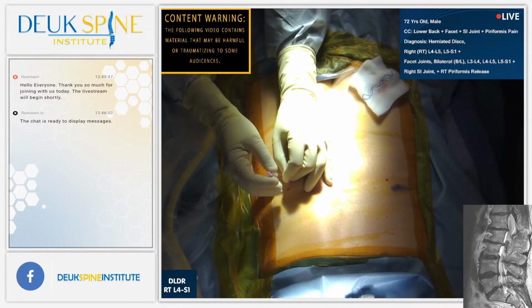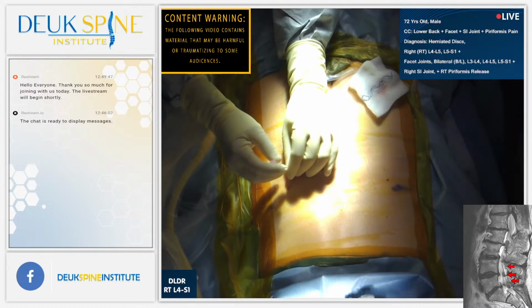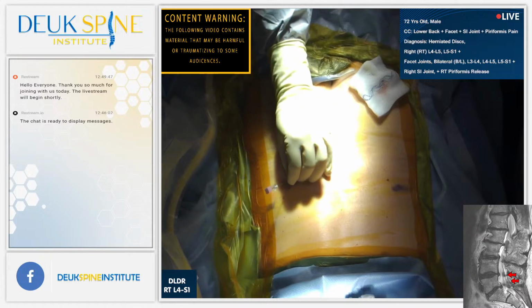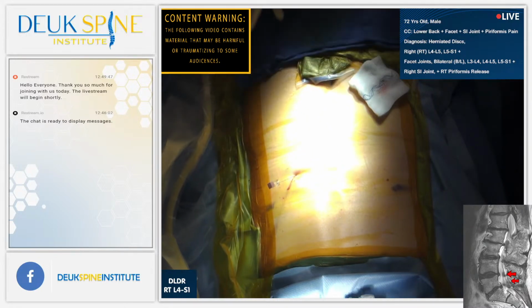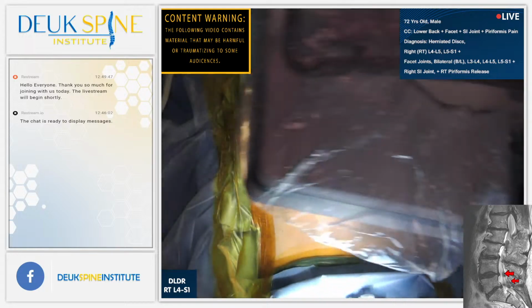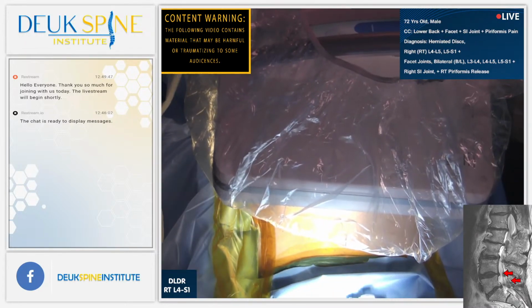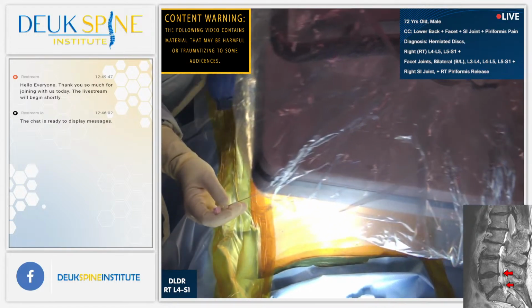Huh. I'm just hitting that bone spur. Yeah, it's no way around it. Interesting. Give me an AP. Again, I think you're off on orbit a little bit. But let's see where we are on AP. See that bone spur? Show us the bone spur. I'm going to try to come from a little more lateral. Sometimes that works.